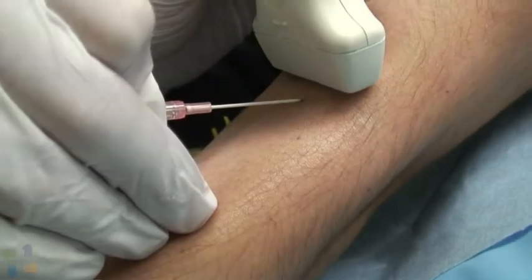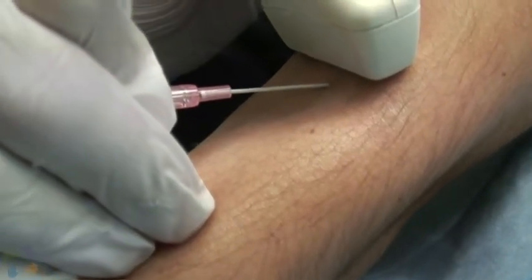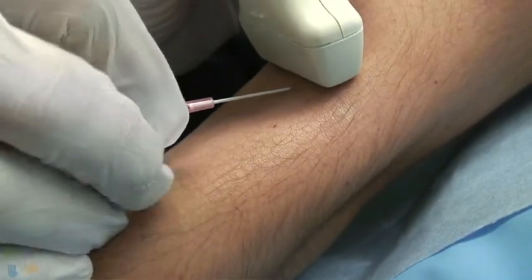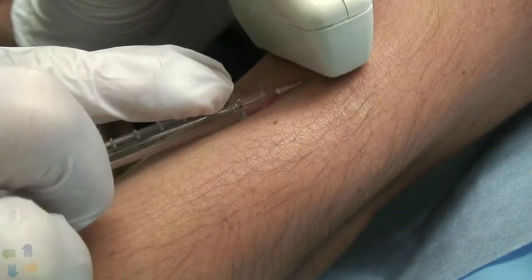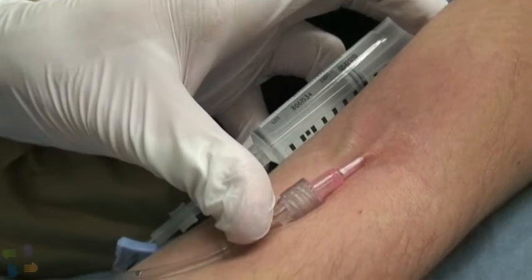When in position, puncture the vein with firm pressure and observe for the flash of blood in the needle. After the flash is seen, advance the needle 1 to 2 millimeters further, then advance the catheter over the needle. Draw blood, flush and secure the line as with any peripheral IV. Be sure to wipe the site dry of ultrasound gel to facilitate securing the catheter in place.